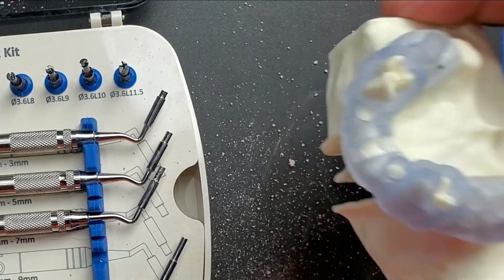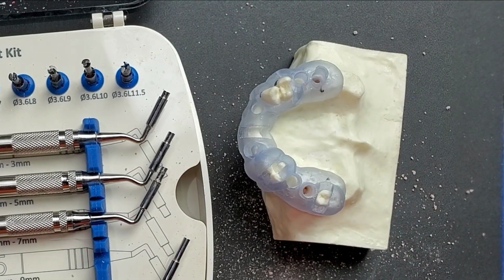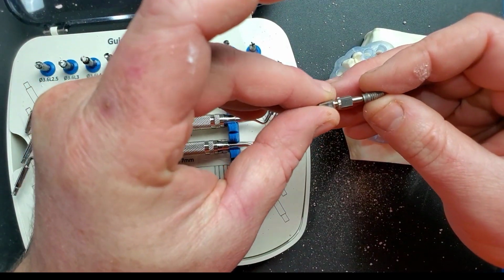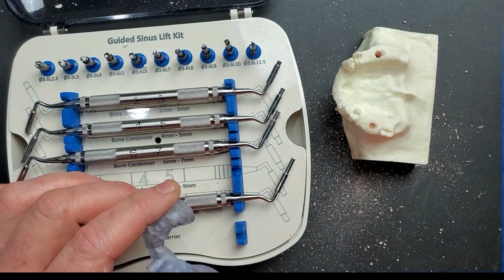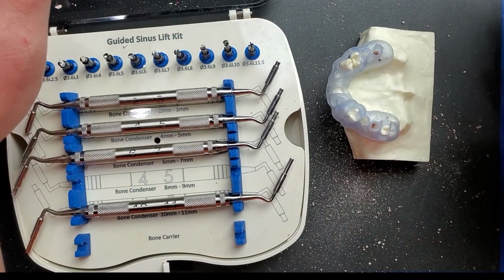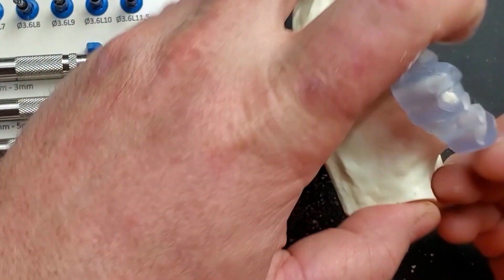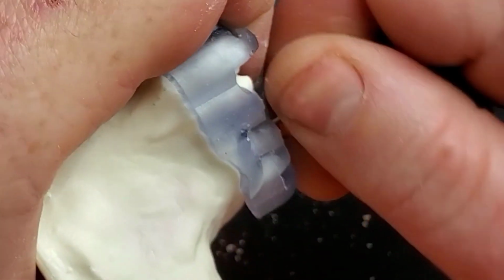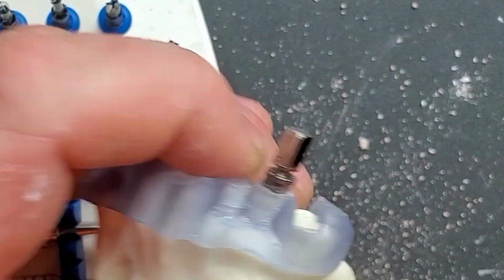So the bone has been placed, the lift has been completed, and now we're ready to place the implant. Now, since I am using this Blue Sky Bio fully guided keyless kit, what I'll do is place this implant on the guided carrier. If you were using another brand of implant, then you could just place it freehand into the osteotomy that you've created here. But again, the beauty of having this all within the Blue Sky Bio systems is that these kits are fully compatible, so I can just grab the exact same keyless drills out of the regular osteotomy kit and begin placing this implant. It goes through the exact same tube here. So I would rotate this in by hand as much as I could. You could use the thumb knob if you want. And once it's too tight to tighten by hand, now you can switch over to a ratchet.